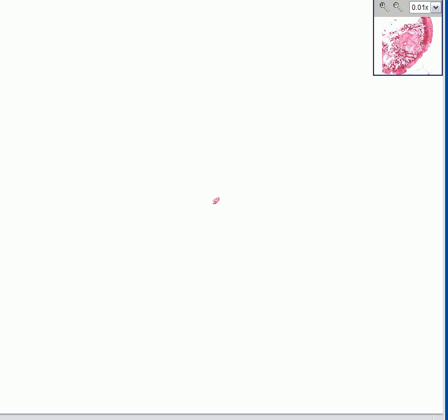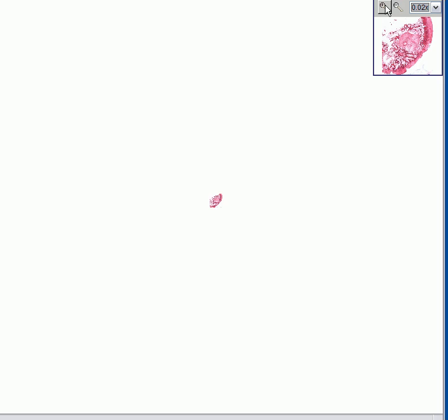Our next case is called osteoarthritis subchondral cyst, and as you can see, this is the entire disease here — just kidding. Let's blow this up a little bit.